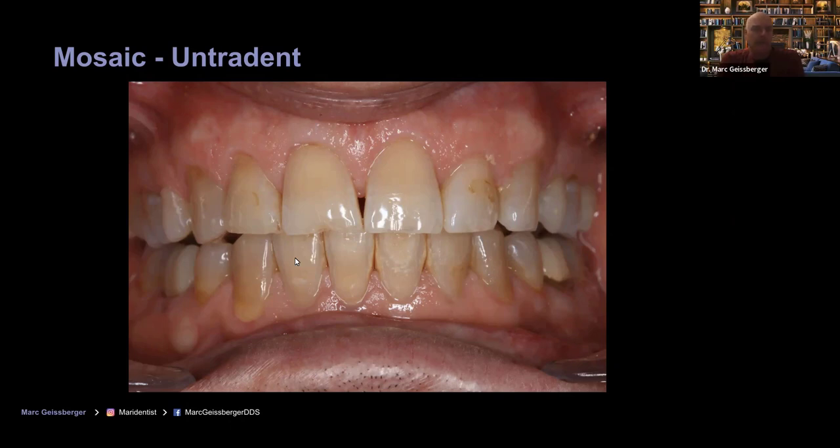So when I looked at this tooth, I recognized, first of all, that the incisal edge, especially on this adjacent tooth, is fairly translucent. So I'm going to stay away from my dentin shades with Mosaic. I know I need to move to the enamel shades. And I don't stock all the enamel shades, but I look at this tooth and I go, okay, if the cervical is an A3.5, I'm going to try on the enamel yellow first. So I'll take the smallest amount of the enamel yellow and try that on. Light cure it and confirm the shade. And because I've learned the shading system, generally speaking, when you see these dark orange to yellow teeth, that enamel yellow will work out really quite nicely.